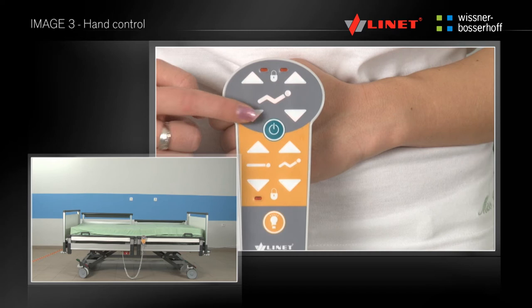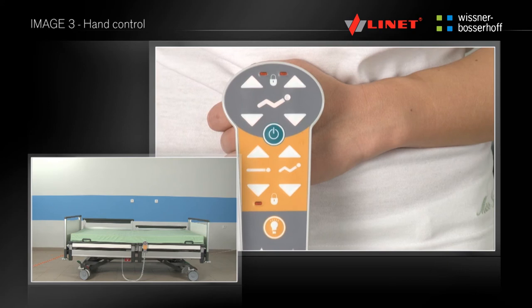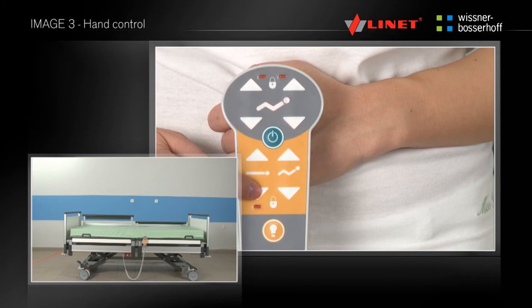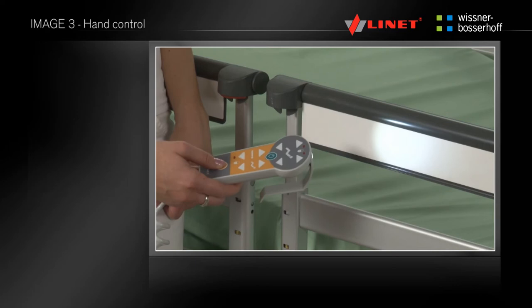You can position on the hand control the thigh part, backrest, height of the mattress platform, and auto contour. If necessary, you can also use the hand control as an examination light.